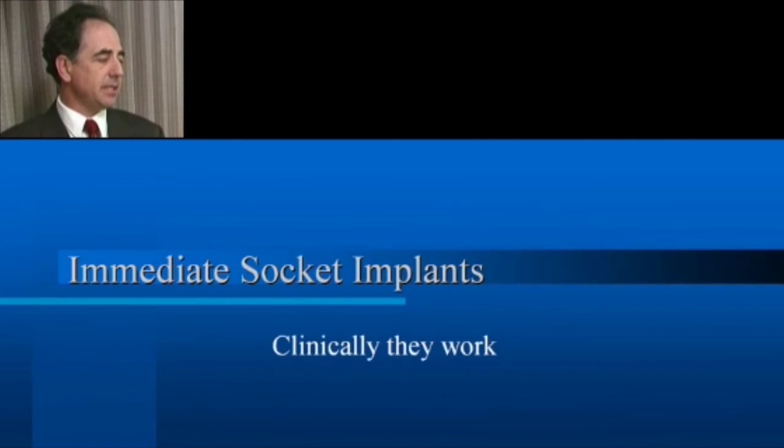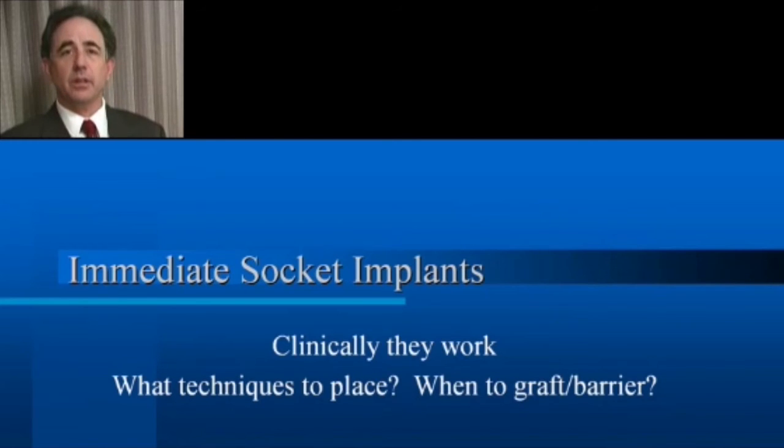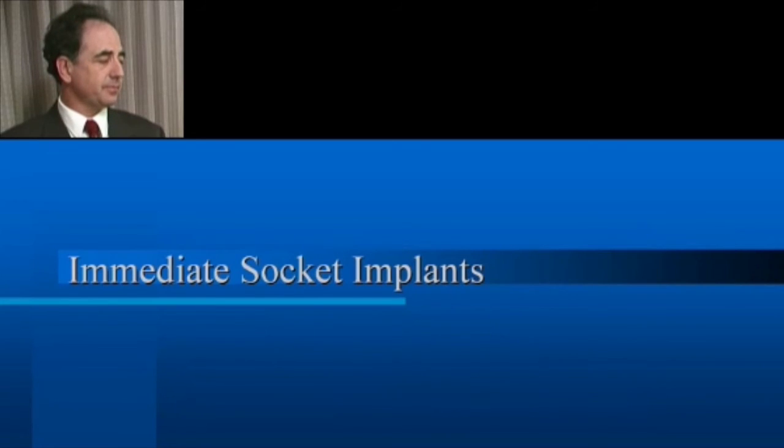Immediate socket implants, we know they clinically work. We are not sure yet which graft and barrier materials to place, nor do we yet know what are the best procedures to use at the time of placement to preserve the alveolar volume.